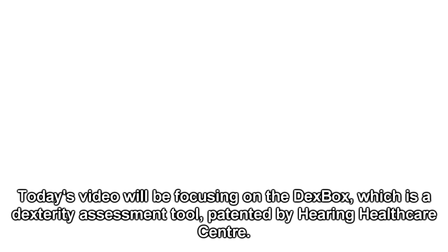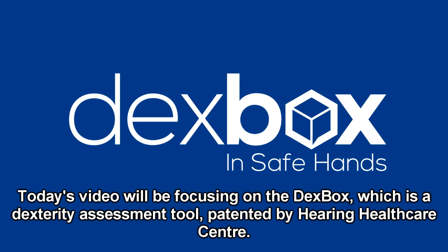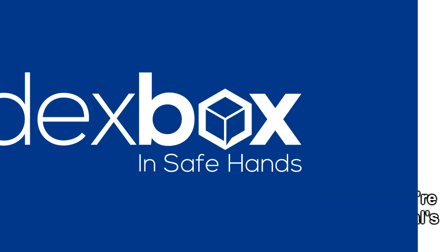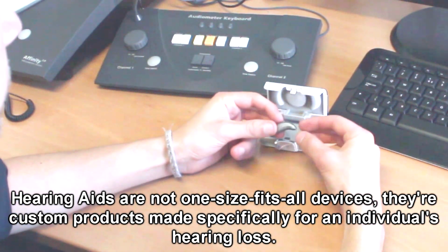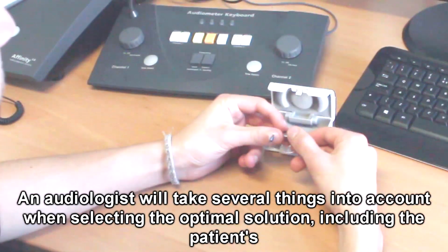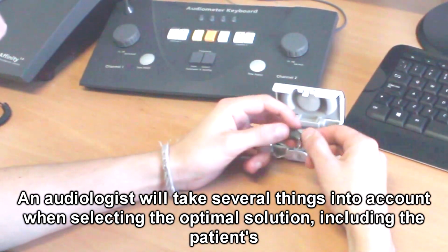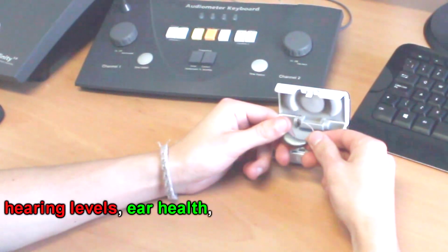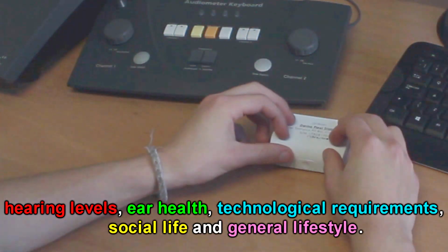Today's video will be focusing on the DexBox, which is a dexterity assessment tool patented by Hearing Healthcare Centre. Hearing aids are not one-size-fits-all devices. They're custom products made specifically for an individual's hearing loss. An audiologist will take several things into account when selecting the optimal solution, including the patient's hearing levels, ear health, technological requirements, social life, and general lifestyle.